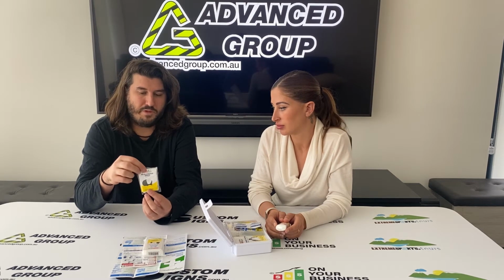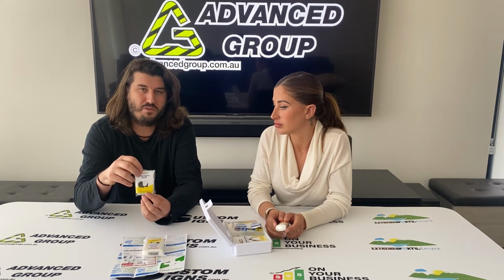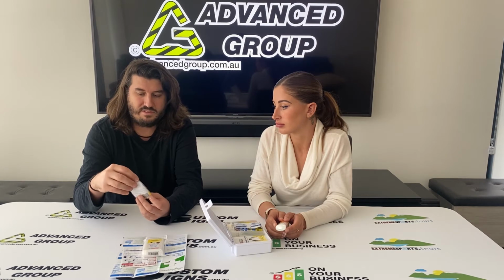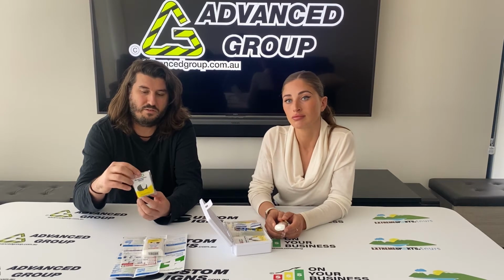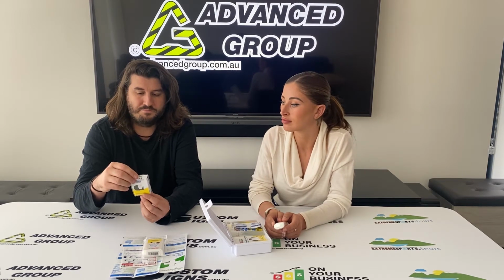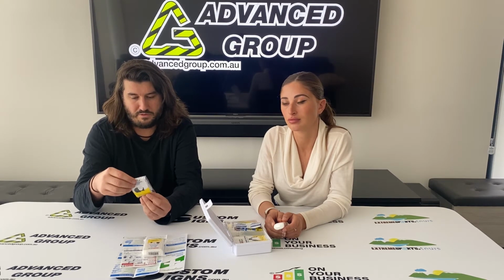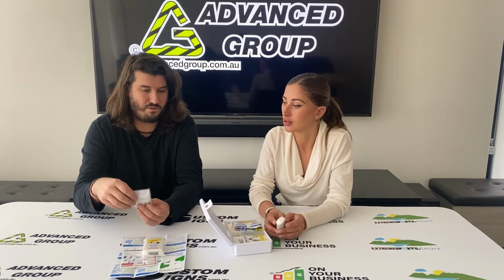Okay, yeah, so some people might be, not even a germaphobe, just doesn't like the thought of having to do mouth to mouth with another person, which is probably fair enough, even if you're not a germaphobe. But this is a resuscitation shield. Single use, it's just one in there, so that if you wanted to use it in the case of CPR, then you would possibly feel a little bit less grossed out by giving mouth to mouth to someone that you might not want to give mouth to mouth to.